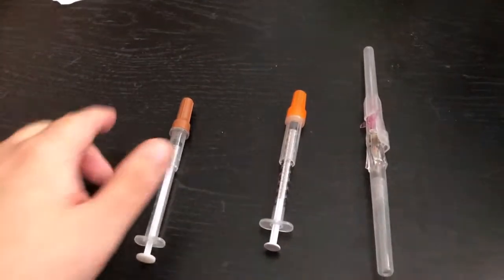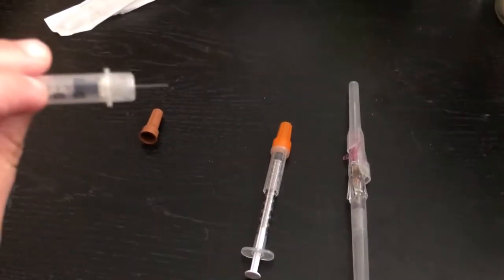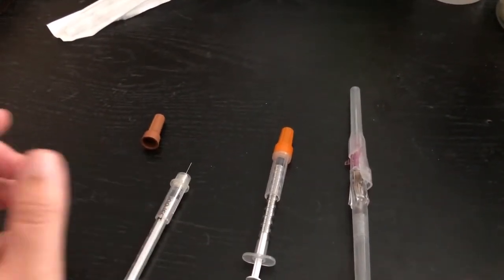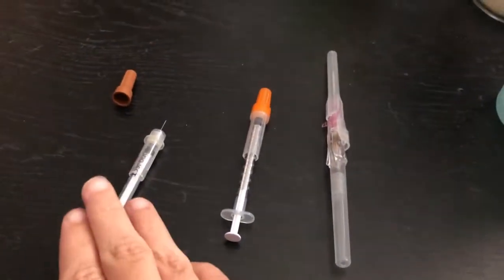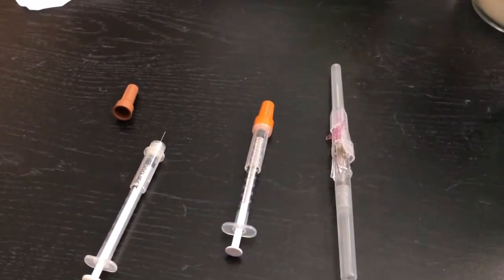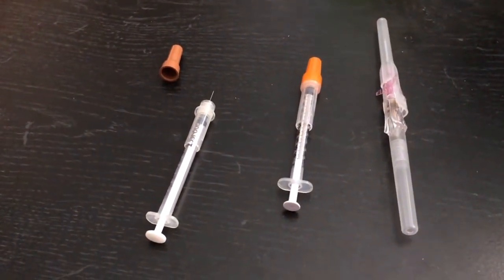But let's uncap one of these needles. I'm going to uncap the tuberculin syringe here. You can see it is a very small needle. If you want to see it more up close, you can go look at my needle video. Now, the girl I went to nursing school with, I'm going to show you the maneuver that she did when she stuck herself, so that you can see just how easy it is to stick yourself.